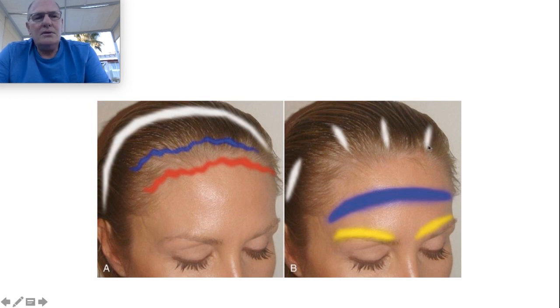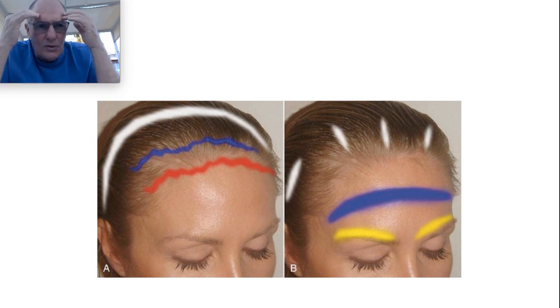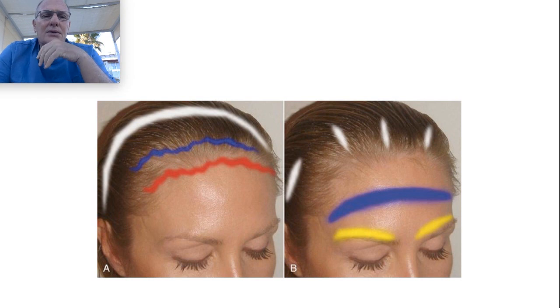This white incision represents the incision to perform a forehead lift, endo-forehead lift. That means you introduce a cannula, and with this reposition all the forehead and the eyebrow, but without removing skin. Then you have all this to remove skin and this long incision, and you have all this for a forehead lift without resection of skin. But also the endo-forehead lift, that is less invasive.